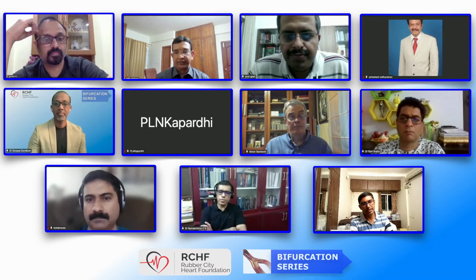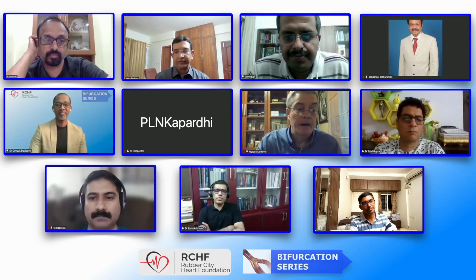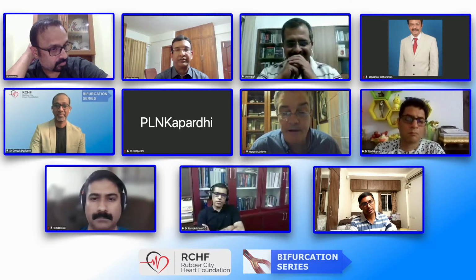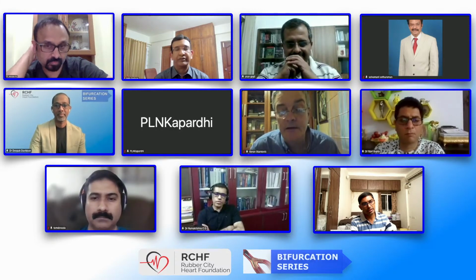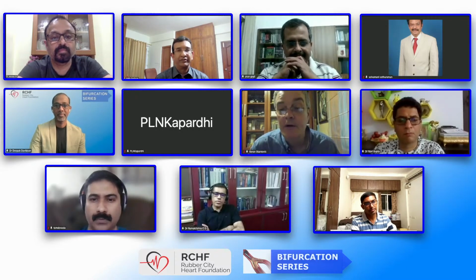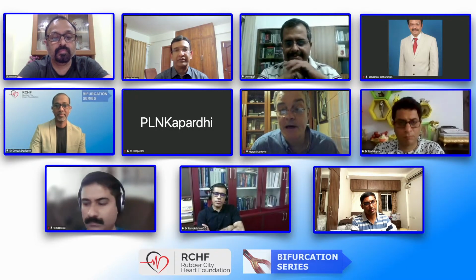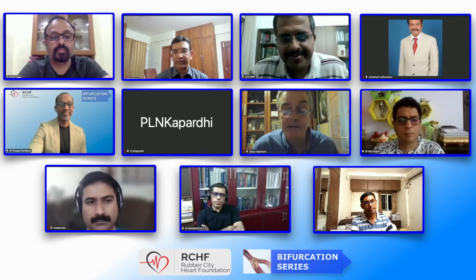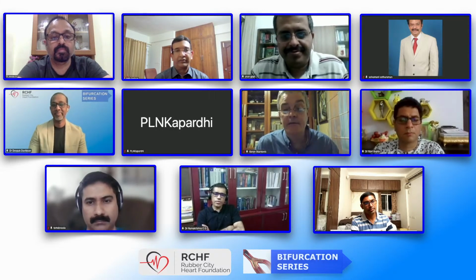Goran? You want to make any comment? I don't have especially additional things to add. I just would like to congratulate on the fantastic illustration. This is for the book, how to do OCT-guided step-by-step culotte in the calcified left main. So I enjoyed the case very much.